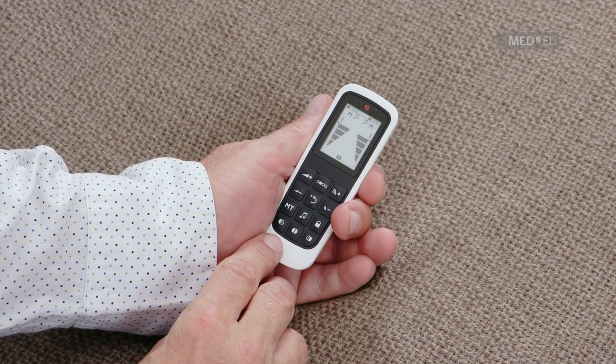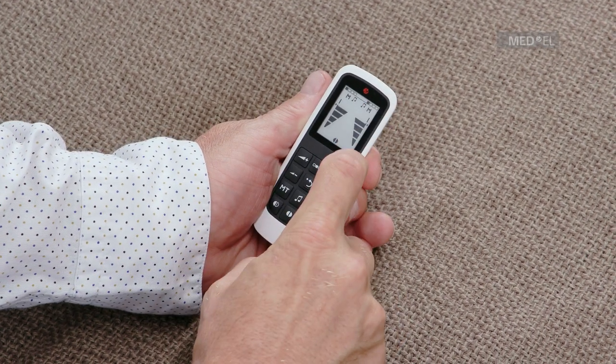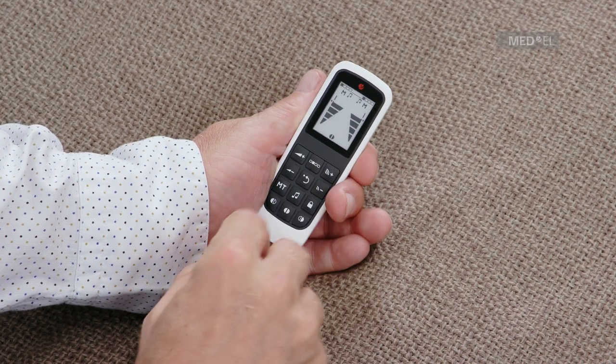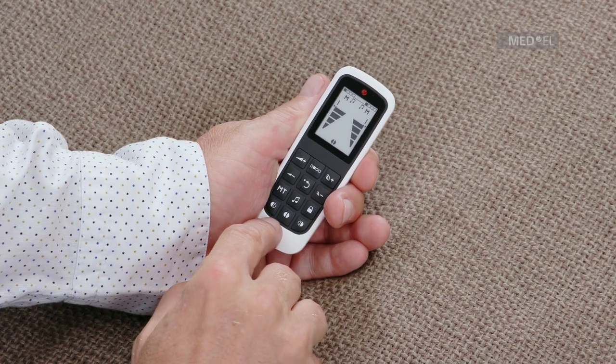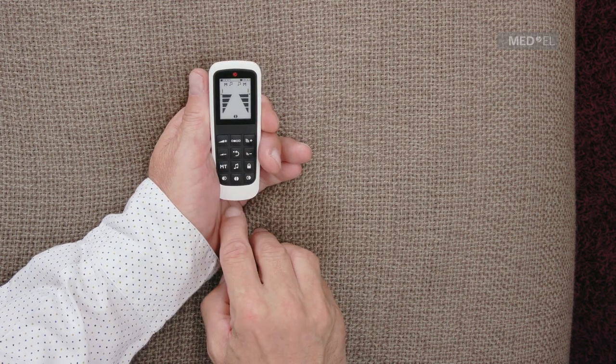All FineTuner Echo functions can be performed with either the left processor, right processor, or both processors. To choose which processor or processors you wish to perform the function with, press the corresponding processor selection key.